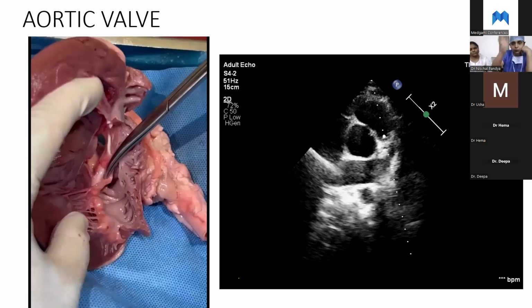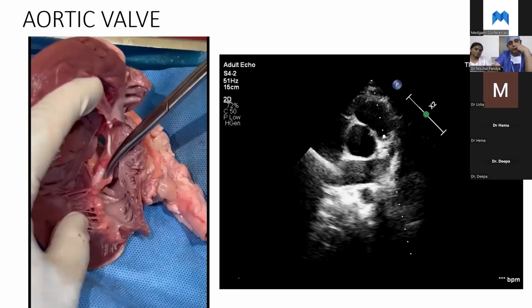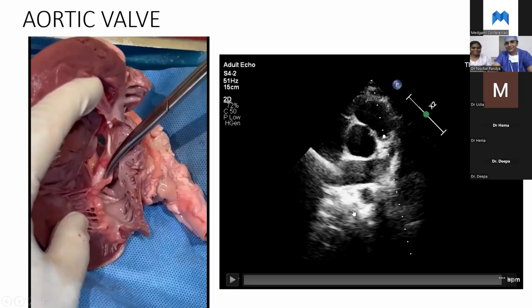And as we keep moving, it keeps going on from RA to RVOT to LVOT. Maybe that's the point where, if an ASD device perforation happens, I think it would probably happen over there. Yes, ma'am. And if you're lucky, it goes high, you'd be away from the cusp. If it goes low, it would go into the annulus and the cusp. Okay, I don't think there's anything lucky about having perforation.